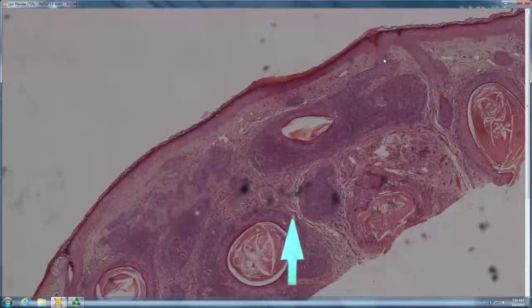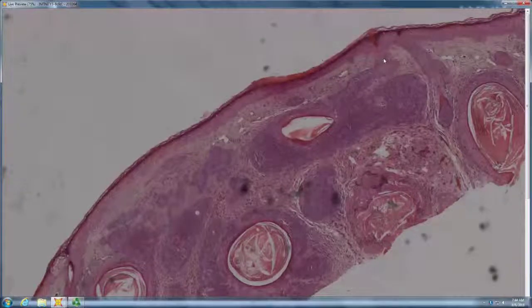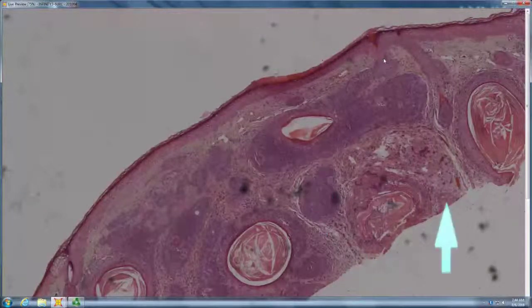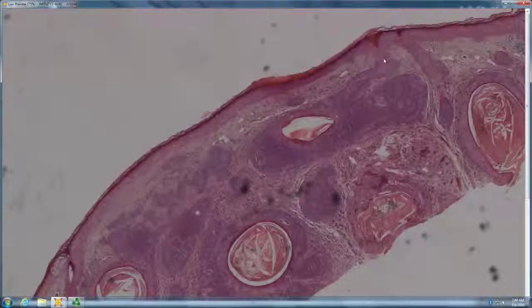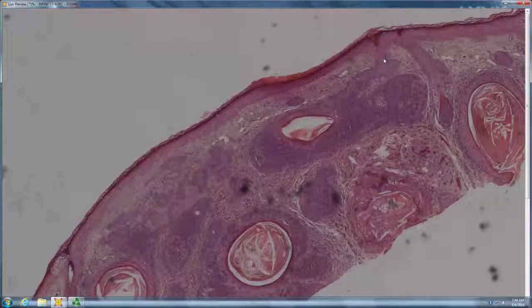The stroma is concentric, fibroblast rich. There are these plump gray collections of papillary mesenchymal bodies. There are horn cysts. There's granuloma where a horn cyst has ruptured. So this is a trichoblastoma. Or this one you might call a trichoepithelioma, superficial well-differentiated trichoblastoma. Either name is fine for it.